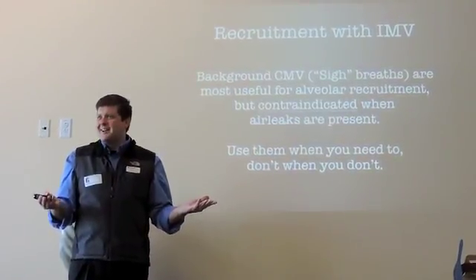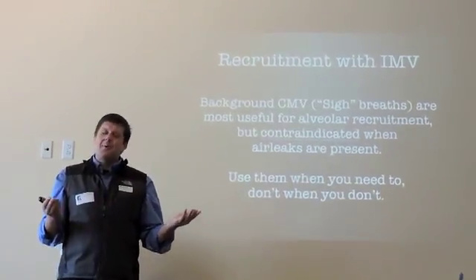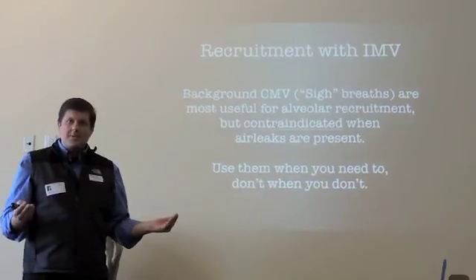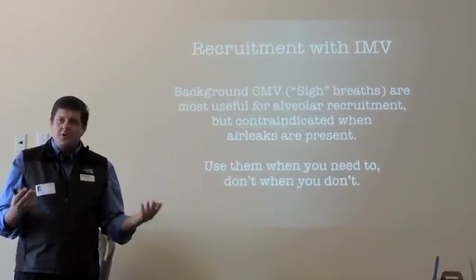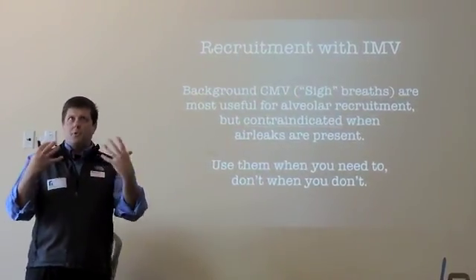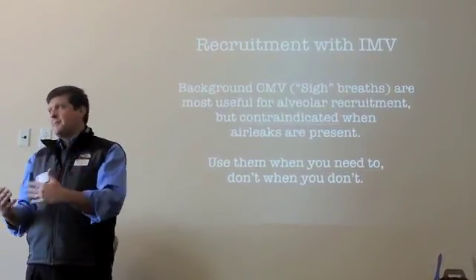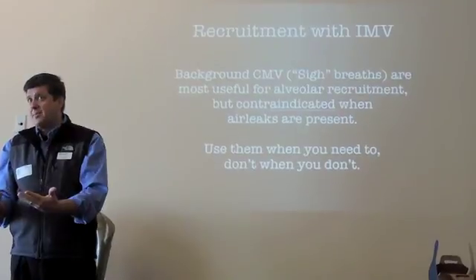That's what he likes. Okay, if we take the background rate away or we reduce it and our SATs drop, then that just simply means we don't have enough PEEP. You shouldn't have to keep re-recruiting the lungs, right? I know it's kind of corny, but lungs should only have to be open once if we've optimized PEEP, right?